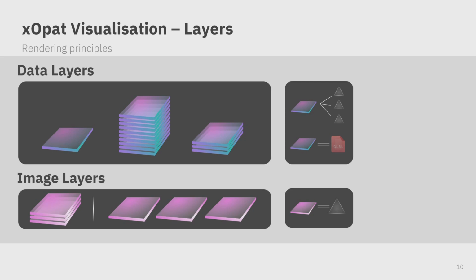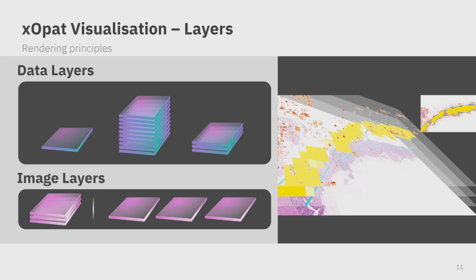The visualization goals specify the data and how they are rendered. Unlike with image layers, each data layer can access an arbitrary amount of raster data files, independently of channels. Each layer also uses WebGL to render its visualization output, using so-called layer shaders.